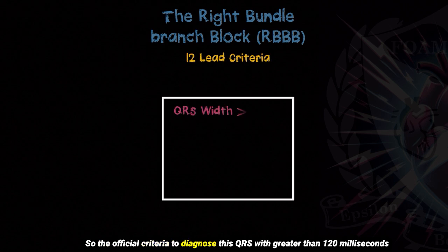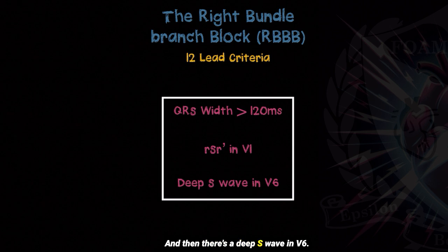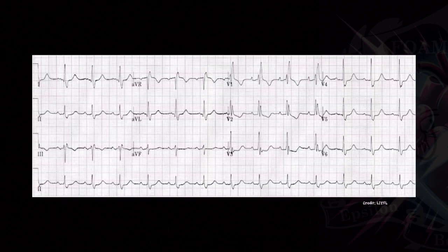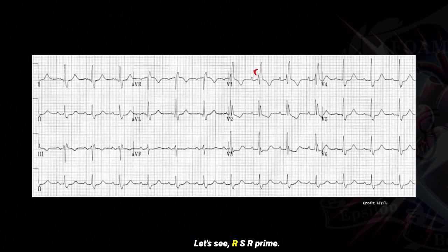The official criteria to diagnose a right bundle branch block: QRS width greater than 120 milliseconds, an RSR prime in V1, and a deep S wave in V6. Looking at another 12-lead example, we can see a slight R, then an S with an R prime pattern, and then a notable S wave in V6.